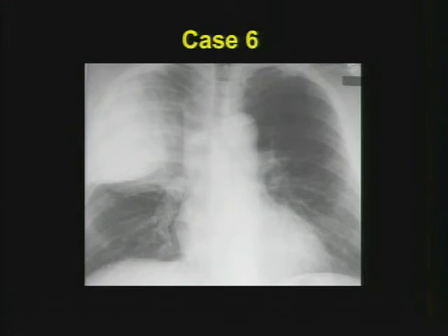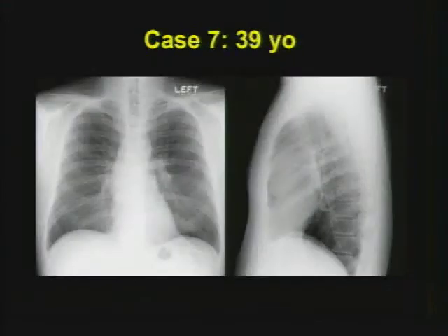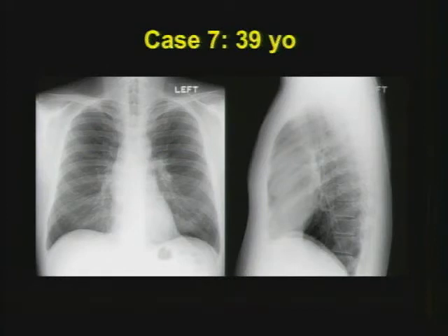What sort of differential could you offer just from the chest radiograph alone? Always use the lateral film if that's provided — it can be very helpful in localizing a lesion into an anatomic compartment. Subtle lesions on a frontal projection can sometimes be very dramatic lesions on the lateral film.